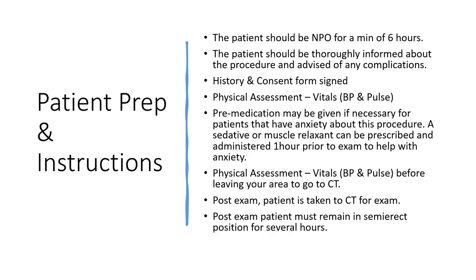Patient prep and instructions. The patient should be NPO for a minimum of 6 hours prior to the procedure. The patient should thoroughly be informed about the procedure and advised of any complications. A history consent form should be filled out. Physical assessment, vitals like blood pressure and pulse, should be taken prior to starting the exam. Premedication is given if necessary for patients with anxiety.